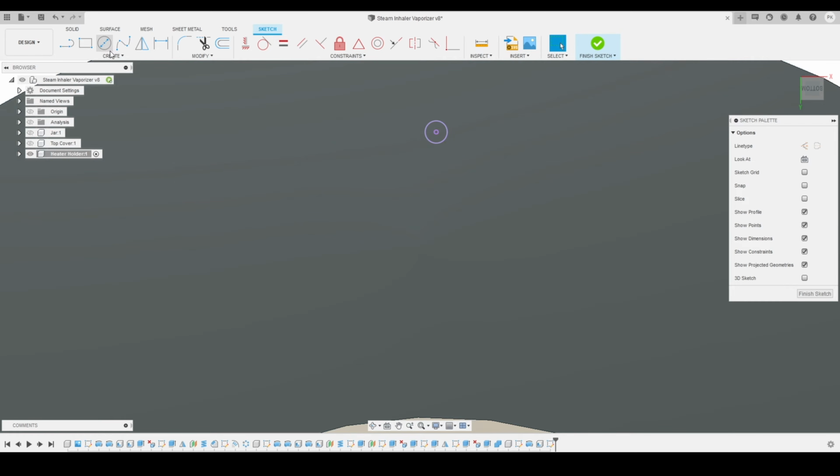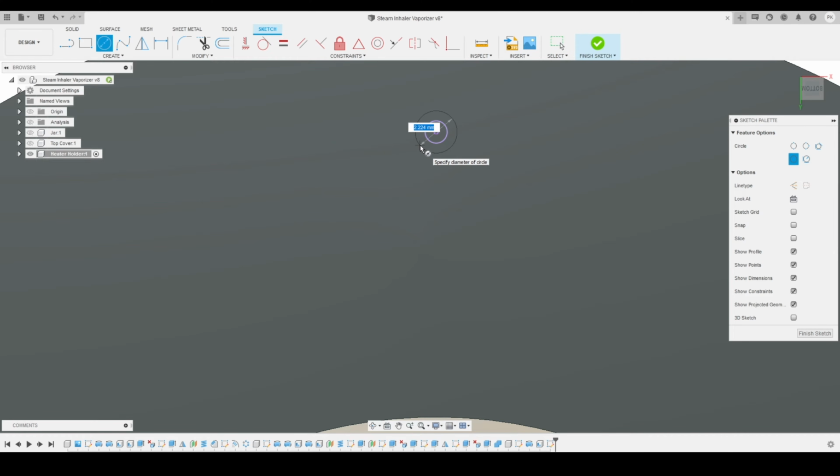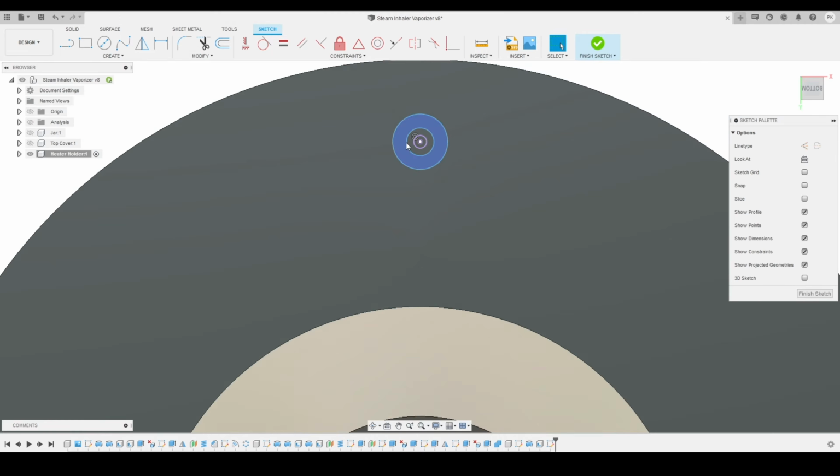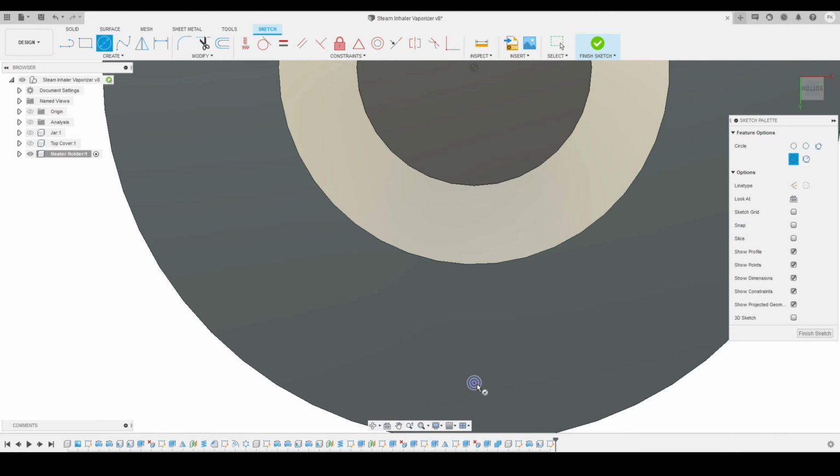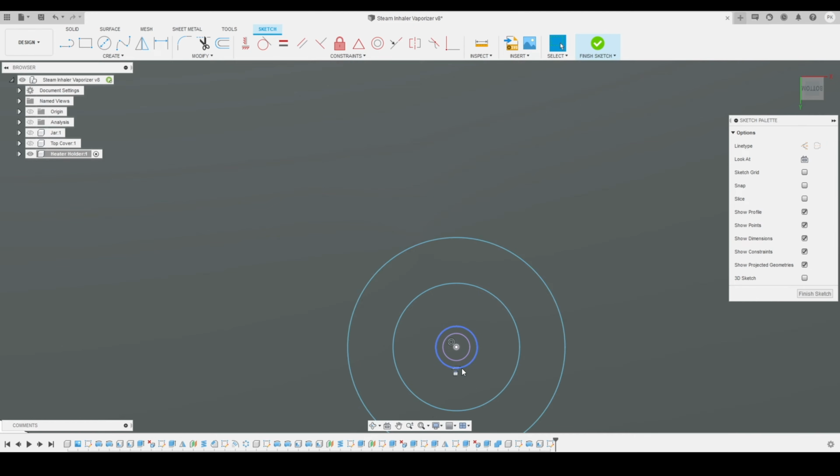Now I will create a few more circles following the same origin. So this time I just want to keep this circle as 3 mm, and here you can see I'm creating more circles. So I'm not defining the dimensions right now because we can do it later also. So first I'm just creating the circles. Here you can see I had created all the circles. Now what I will do, I will just convert these projected sketches to construction line.